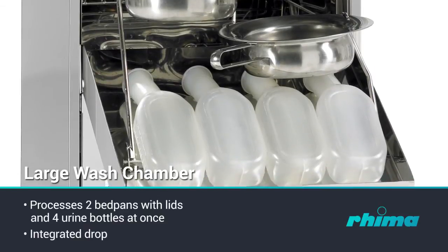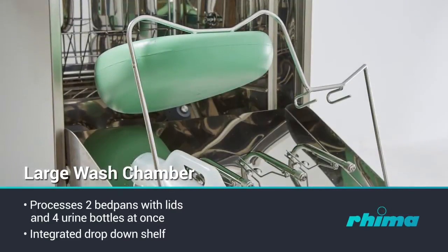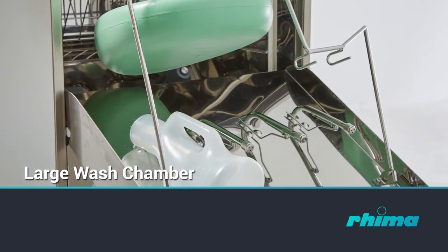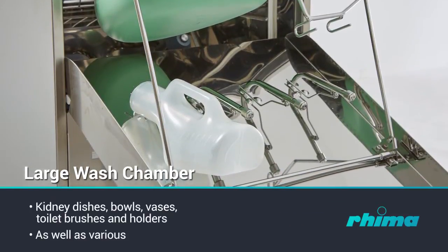The integrated drop-down shelf provides space for four hand-wash basins or a mop bucket with seating ring. The shelf can also be utilised as a base to accommodate and process inserts and washing accessories, e.g. kidney dishes, bowls, vases, toilet brushes, holders, as well as various hollow ware.